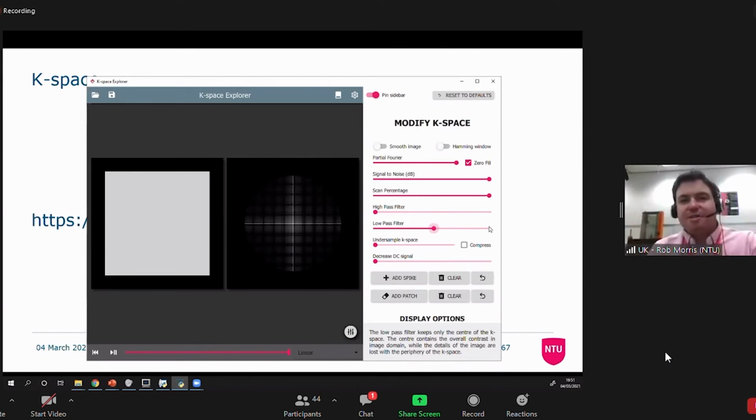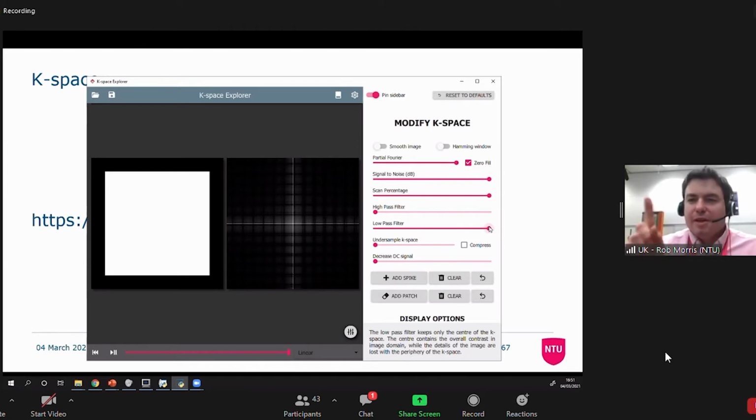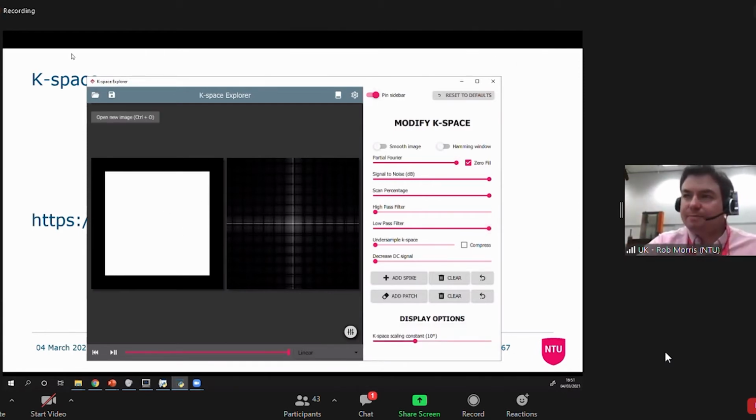And if you collect this one, you've collected some arbitrary pixel in your image. That is not how it works at all. Every point in your image, if you pick one single pixel, has used every point in K-space to work out what's in that pixel. And that's why we need this fast Fourier transform rather than somehow trying to do it from a Fourier analysis by hand. Every single point makes up every single point in your final picture.